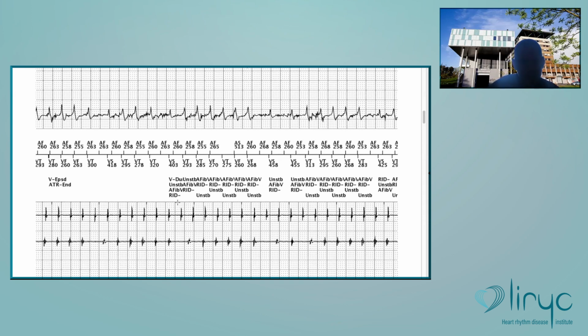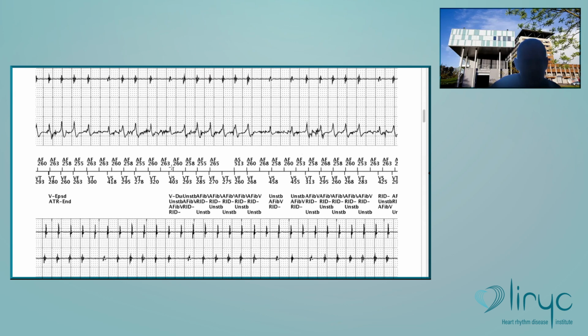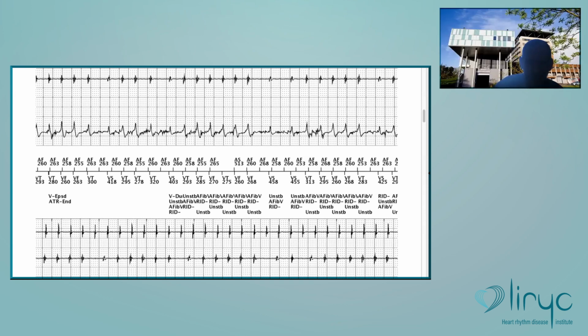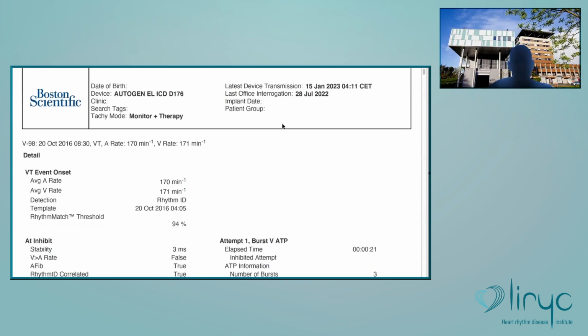So that's the time where there is an analysis of atrial fibrillation. So you analyze the last 10 and 1, 2, 3, 4, 5, 6. So there is a diagnosis of atrial fibrillation, but it's unstable. You see, it's very unstable here. So if it is unstable, it is considered a conducted atrial fibrillation and no therapy is delivered. Okay? Are you still following the different steps? Okay, number 3.